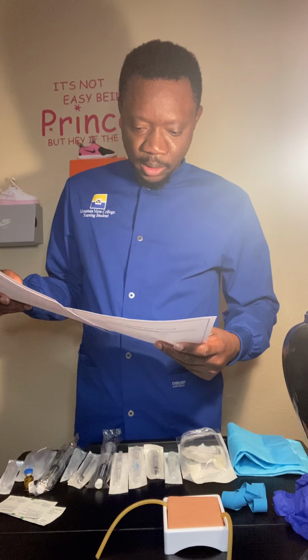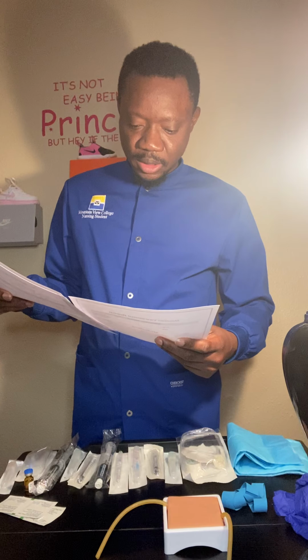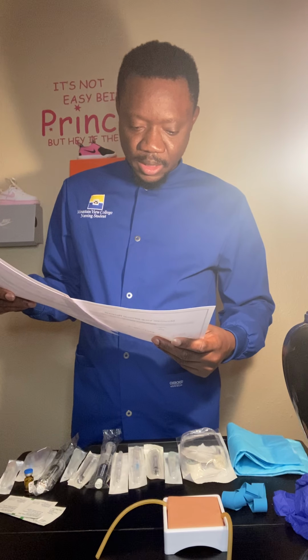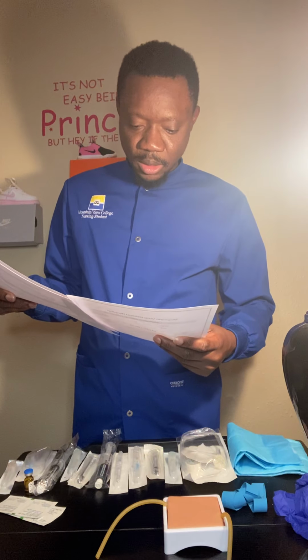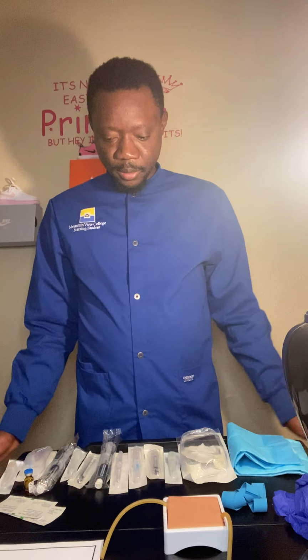So my medication record says Wanda Chi, date of birth 9/20/20 SX, start IV now by 9 a.m. Mepridine 50 mg, IV. Okay, so my medication record matches with my official orders. So I should go ahead and go to my medication room and pull out my medication, and that will stand as my first check. So I pull out my medication.